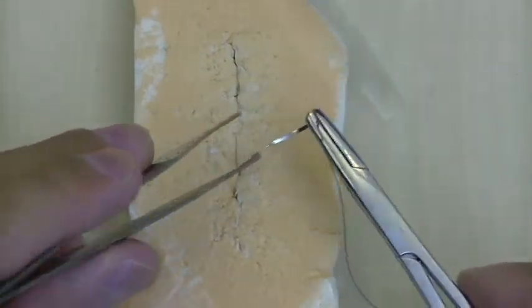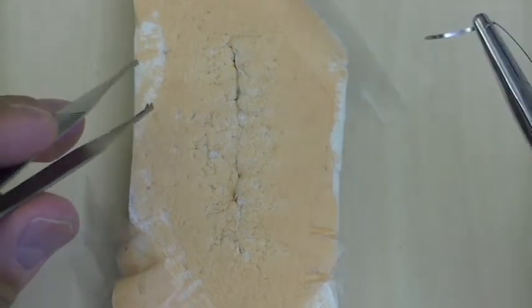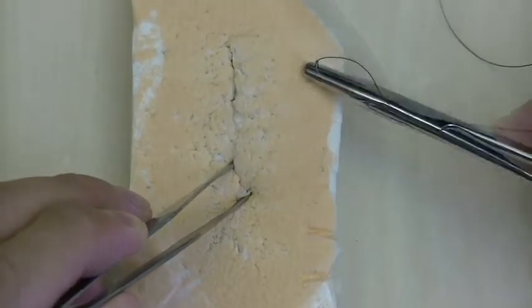You don't have to go in any particular direction, because in general you're going to see bleeding and oozing and you're not really going to see the blood vessel it's coming from. So you can just try and go around the bleeding, go deep, come out.